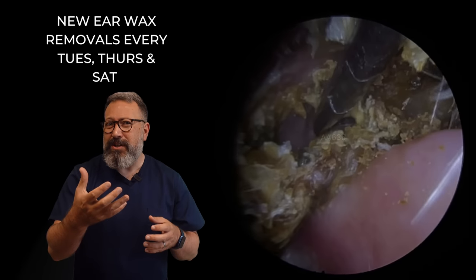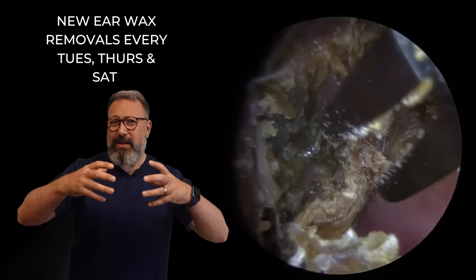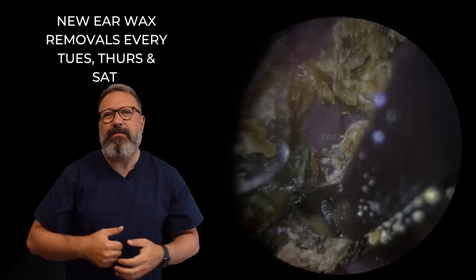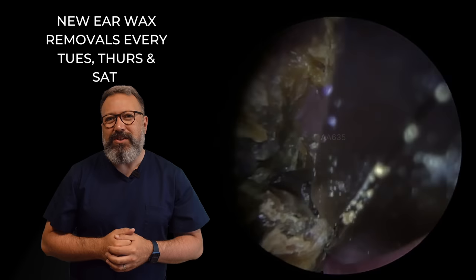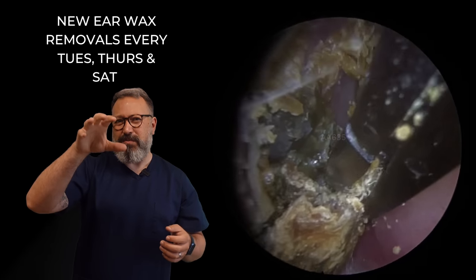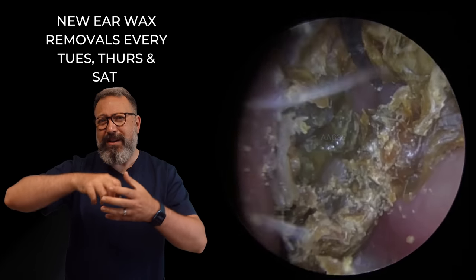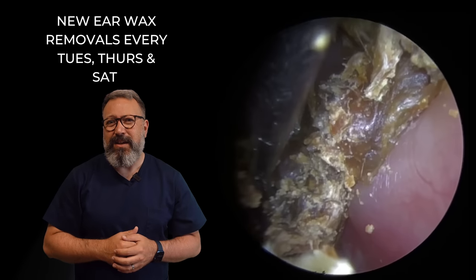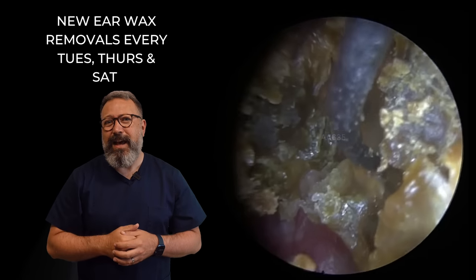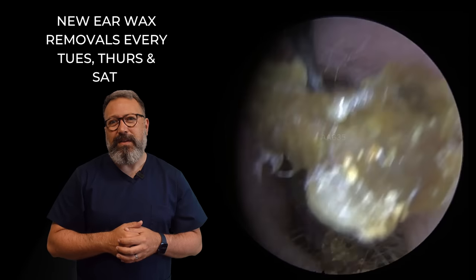You saw a little bit of movement to the bottom section there. The top section is starting to sort of move, but it's so crumbly that when we're gripping it with the St. Bart's hook, the hook is just ripping that particular part of the wax plug apart. It's like the nemesis for all the tools here because the alligator forceps is struggling to get hold of this, and it's really crumbling and breaking down. Remember to loosen it with tools and then use others to get this out. Oh, look at that coming away — can you see that at the top there? A big chunk coming away — that was a good size piece.